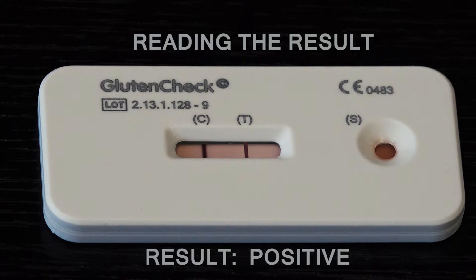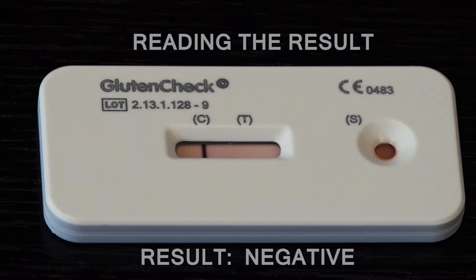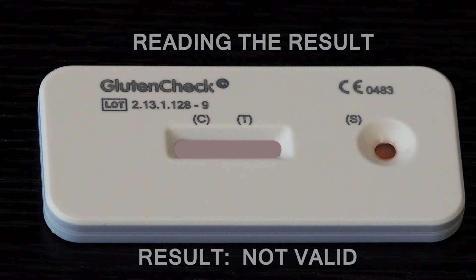If a faint pink to red control line C is visible in the result window along with a faint pink to red test line T, the test result is positive. If only a faint pink to red control line C is visible in the result window with no test line T, the test result is negative. If there is no control line C or only a test line T in the result window, the test did not run correctly and the results are not valid.